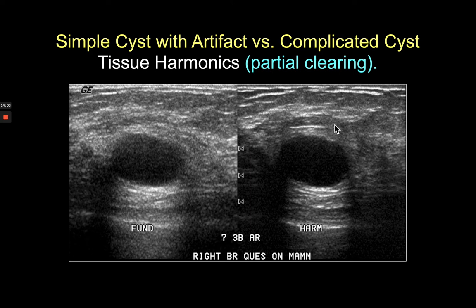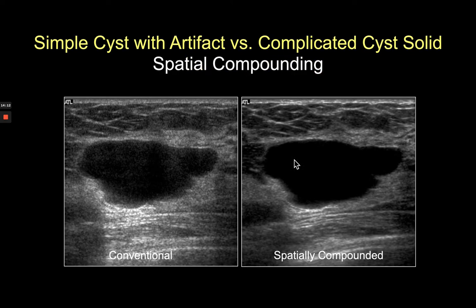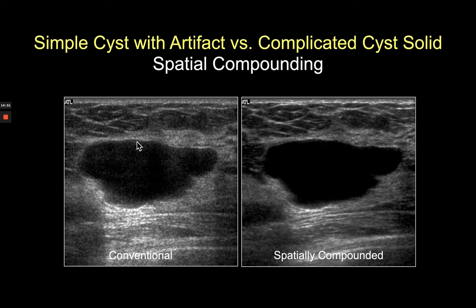Split-screen images show a complicated cyst with fundamental imaging on the left and harmonics on the right — harmonics clears most internal artifacts. Spatial compounding similarly clears clutter artifact from the cyst. In the old days, only high-end machines had harmonics or spatial compounding. Now even mid-range and lower-end machines can have both. My default presets for breast ultrasound always include spatial compounding and tissue harmonics.